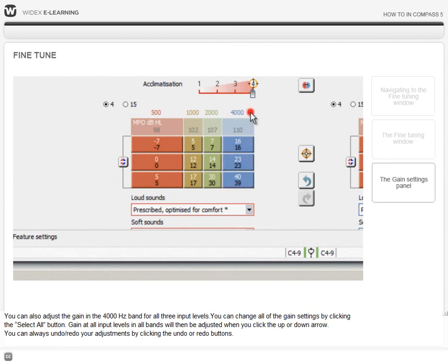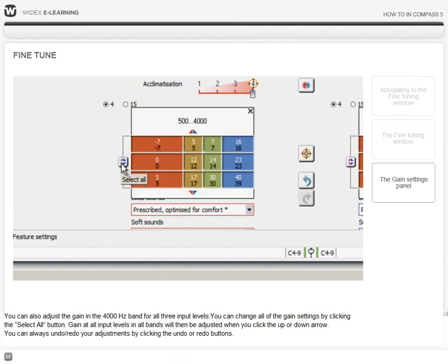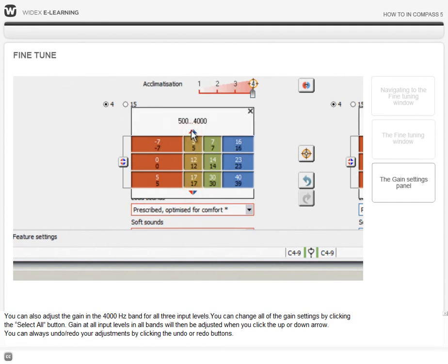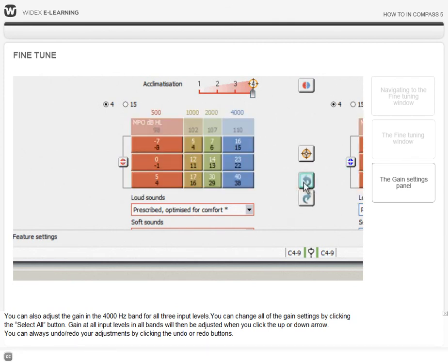You can also change all of the gain settings by clicking the Select All button. Gain at all input levels in all bands will then be adjusted when you click the up or down arrow. You can always undo or redo your adjustments by clicking the Undo or Redo buttons.